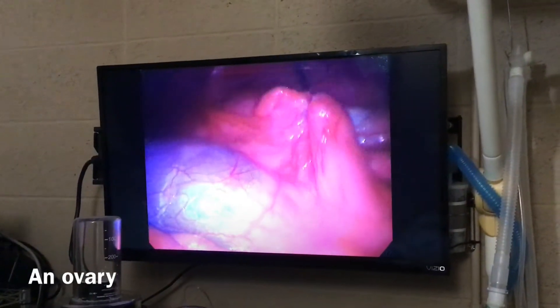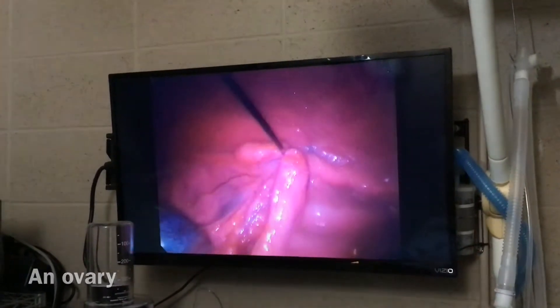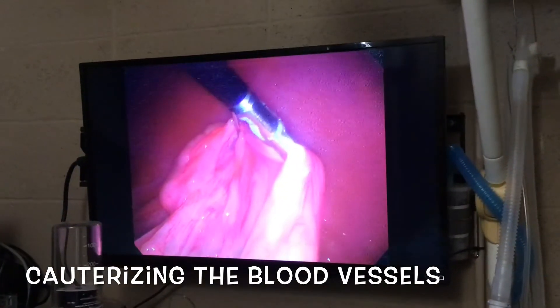The camera sends images to a video monitor that allow us to perform the surgery inside of the patient. Instead of using suture, we use cautery, which uses heat to stop bleeding during surgery.